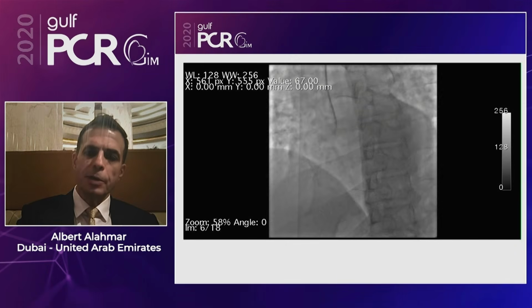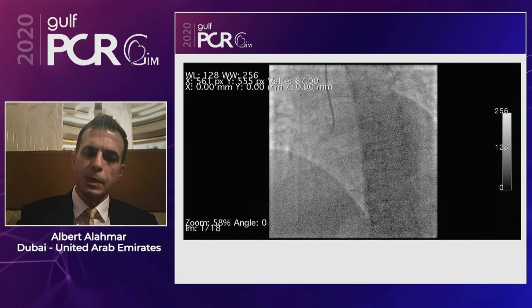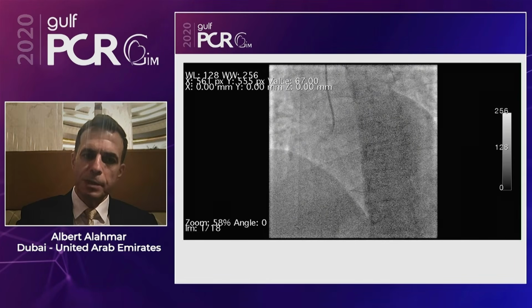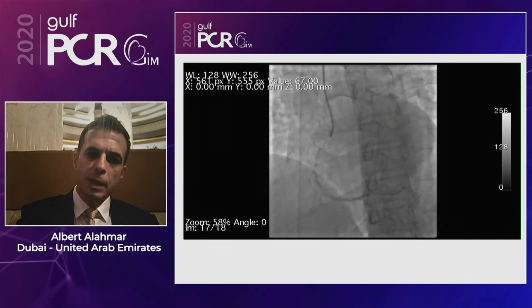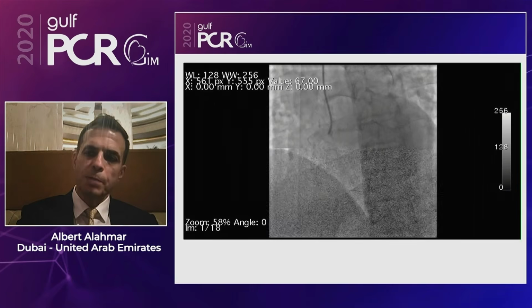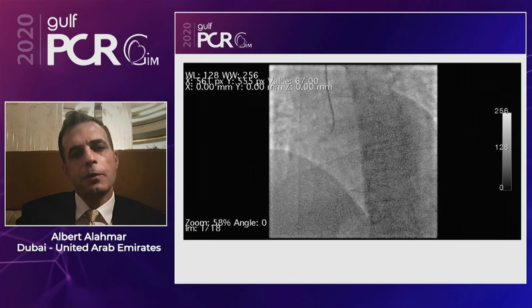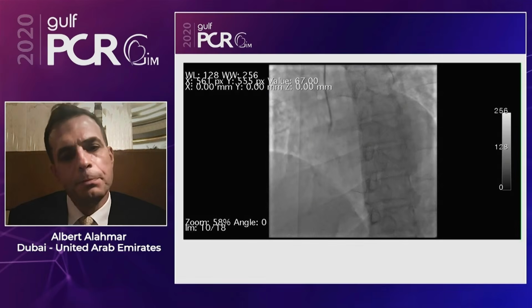This is the right coronary artery, which has severe ostial disease. It's a dominant vessel, almost retrograde, filling the left system. I brought him in as a first stage with intra-aortic balloon pump support. We were planning Impella, however, due to the financial cost, we elected for the intra-aortic balloon pump.